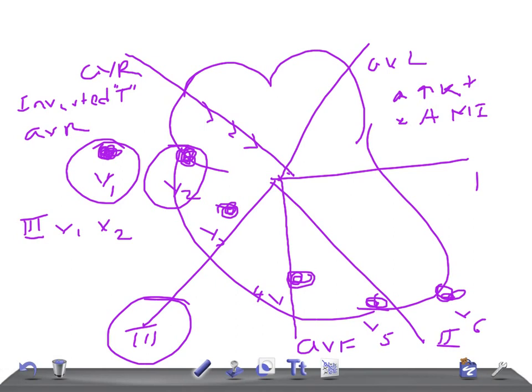Hyperkalemia can cause tall, tented T waves, and may also cause widening of the T waves so that the entire ST segment is incorporated into the upstroke of the T wave. Hyperkalemia can also cause flattening and even loss of P waves, lengthening of the PR interval, widening of the QRS complex, and arrhythmias. If you see tall T waves, measure the potassium level — that is very important.